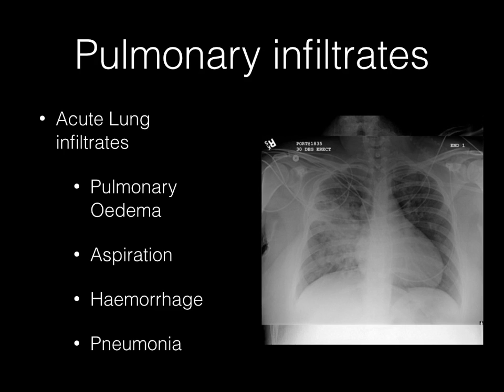Radiographically, when you follow up these patients, if it's only an aspiration pneumonitis, in those situations, the infiltrates will start improving by the end of the third day. If they haven't really improved or they have worsened, then it indicates the presence of probably a secondary infection.